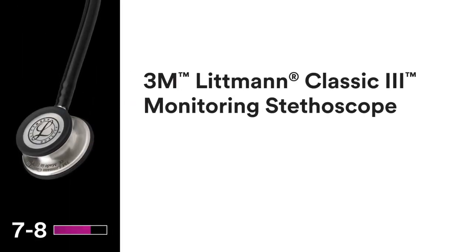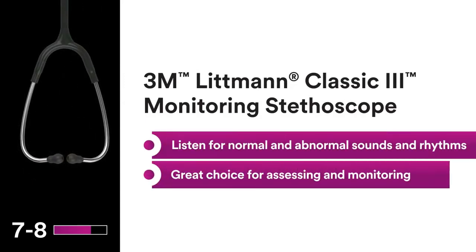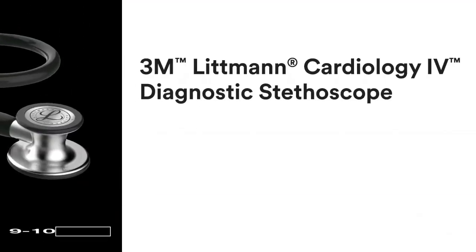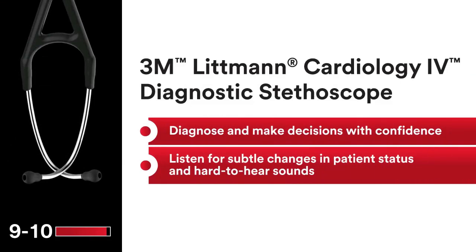Dual-sided chest piece provides versatility of both a tunable diaphragm and open bell. Teardrop-shaped chest piece for easier positioning under blood pressure cuffs and around bandages. Tunable diaphragm — hear high or low frequency sounds by slightly adjusting pressure on the chest piece. Soft-sealing ear tips provide an excellent acoustic seal and comfortable fit.